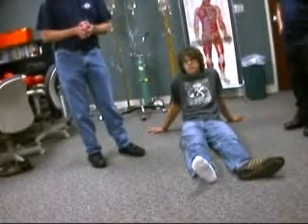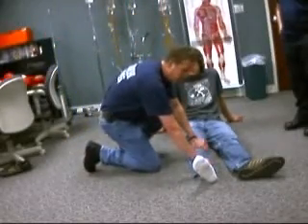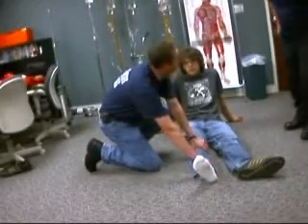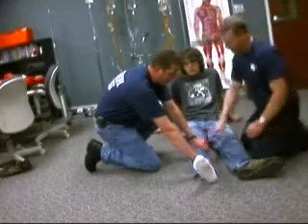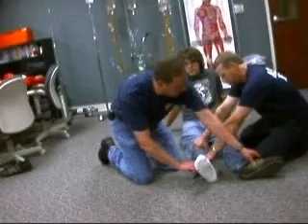Alright, first thing — BSI, scene is safe. I'm going to come down and take manual stabilization of the fracture site. I'm going to pass that off to my partner — if you can come please and stabilize. I'm now going to check bilateral SMCs and pulses.